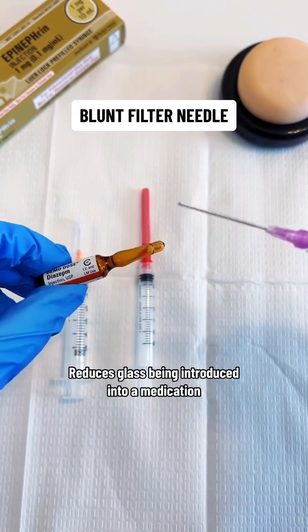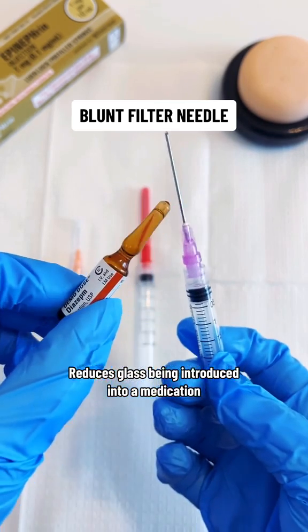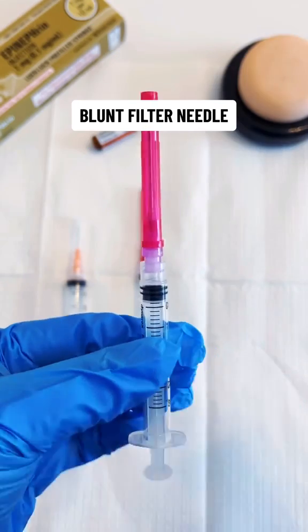If you were going to score or break open a medication and draw up what's inside, you don't want glass going into your patient, since it can cause a pulmonary embolism or phlebitis. So we use this filter needle to make sure glass doesn't get introduced into our patient.